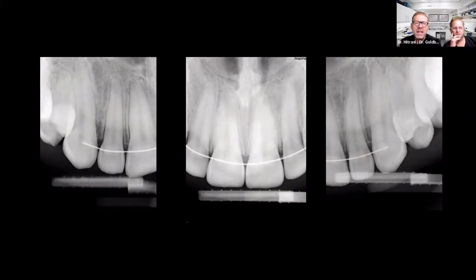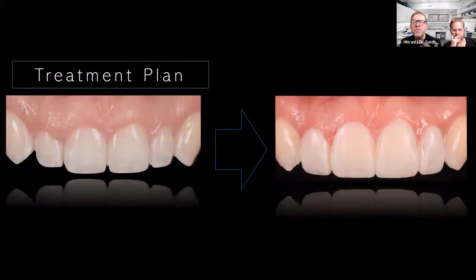Now, while this is very important because it will dictate the type of plastic periodontal procedure that we need to do, it does make sense for us to present to the patient the what if, how the patient would look if we were to carry out this aesthetic enhancement. One way that we as restorative dentists typically communicate with patients is via a mock-up. You could either do a digital wax-up and then 3D print, or do a conventional approach in which you do an actual wax-up, then a silicone matrix, and a mock-up so that the patient can see where we're bringing that gingival margin to a more equigingival position compared to those canines, and also raising the gingival level of the laterals.